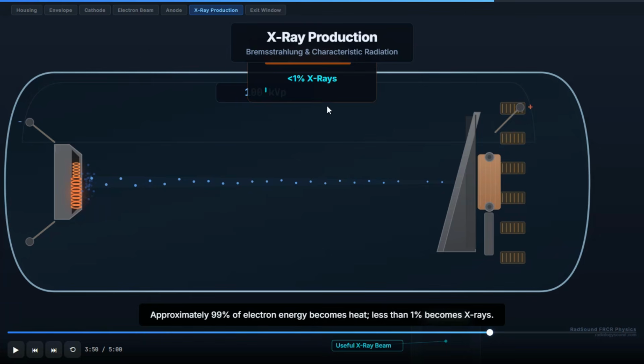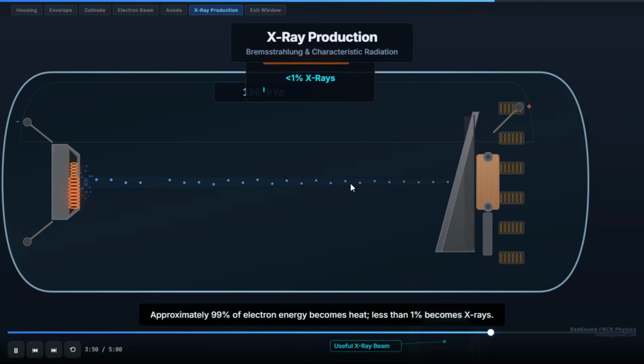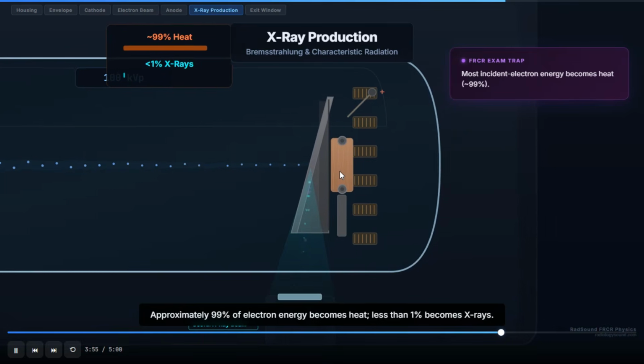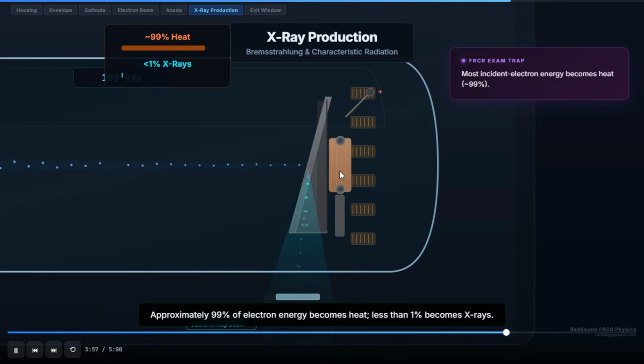Another part of it will be convection, toward the insulating oil. So we have convection, mostly inside the insulating oil toward the housing. We have conduction around the anode. We have thermal radiation within the vacuum, inside the metal or ceramic tube envelope. We have convection inside the oil. So remember these three important methods because they're very important. Convection is always on the outside, not inside the vacuum.